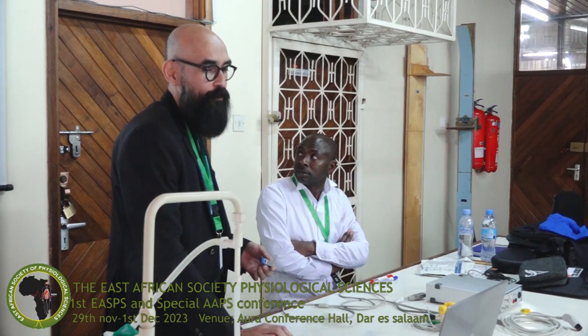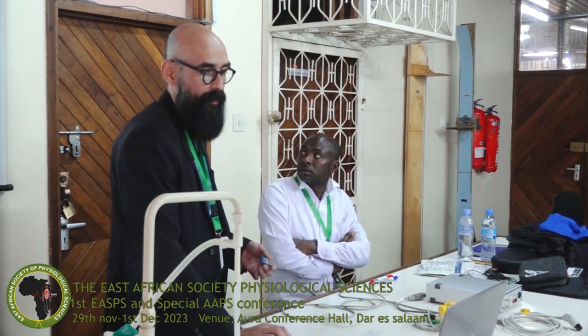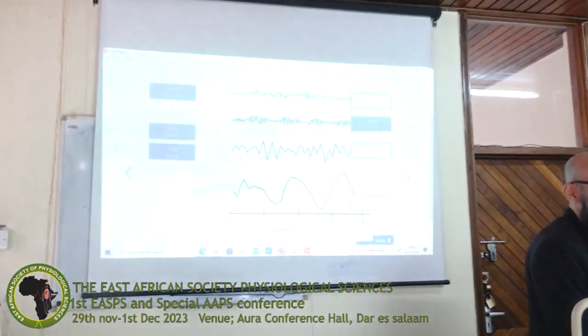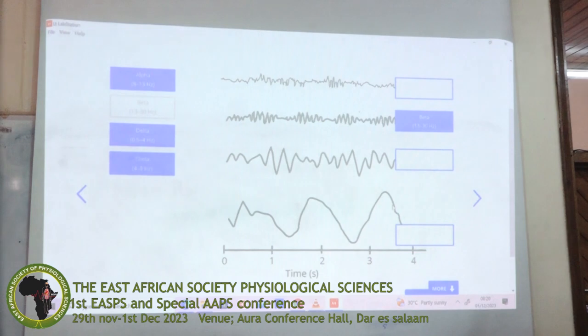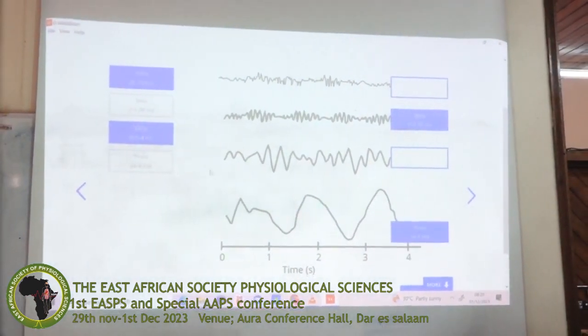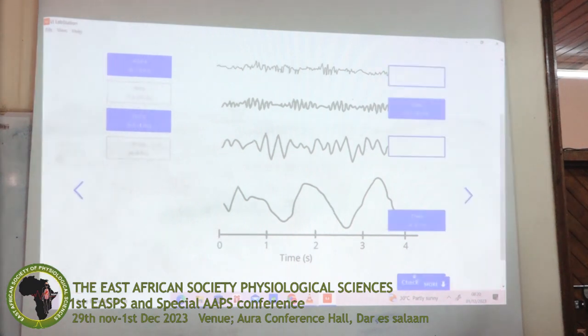So if you're a student, let's pretend, you start to say, well, what about this will be beta, right? Theta, well, if you take a look at the frequency content, is this moving fast or slow? Slow. So probably that will be theta. What do you think? Is that right? So the system says, no. So what about there?